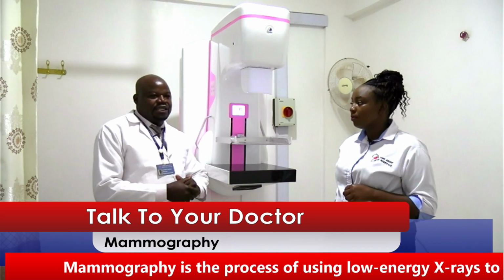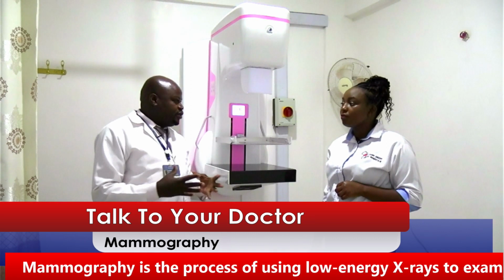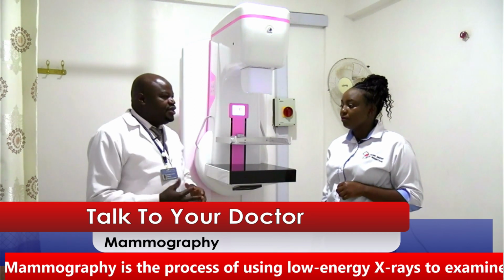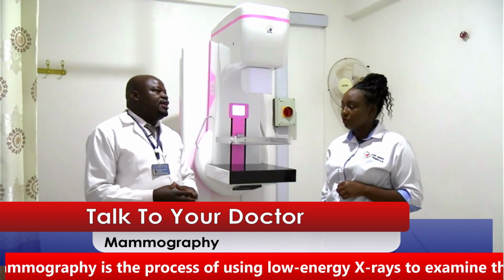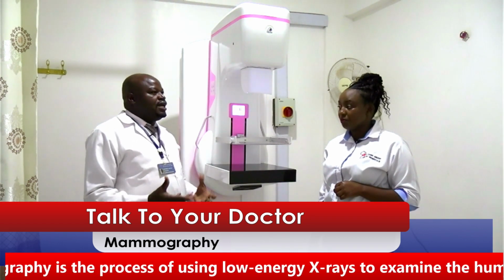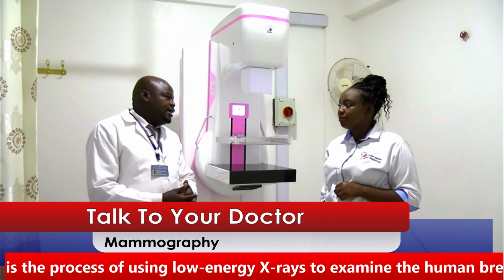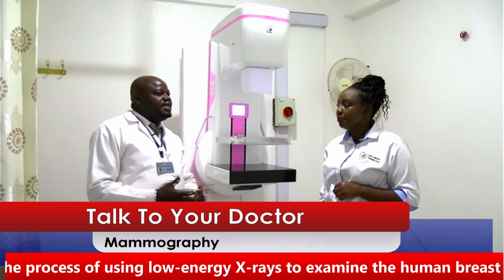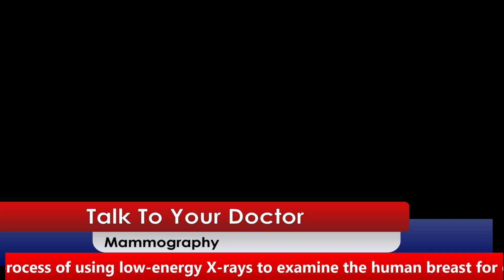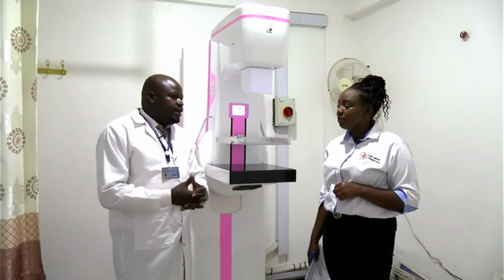I'm going right away to talk about screening mammography. Screening mammography is an examination that is done for a client, not a patient. The client will discuss the issues of their breasts with the doctors. The doctors will maybe physically examine the breast for the client. Then, if the doctor feels nothing within the breast, they can send the client for screening using the mammogram. These clients are asymptomatic. They don't present with anything concerning their breast, but they just want to screen to know whether there is anything that can be detected using the mammogram machine to be able to know about their breast condition.